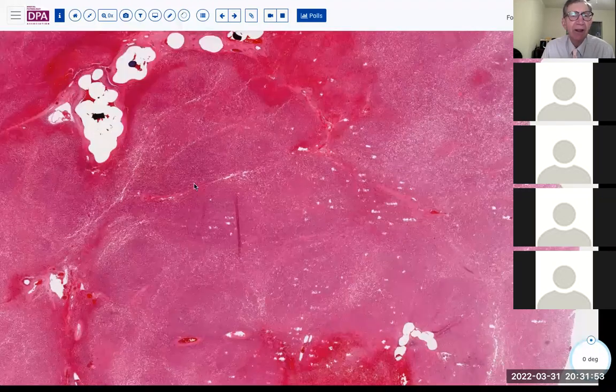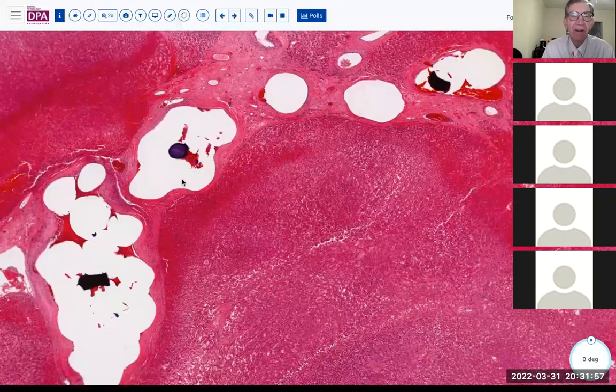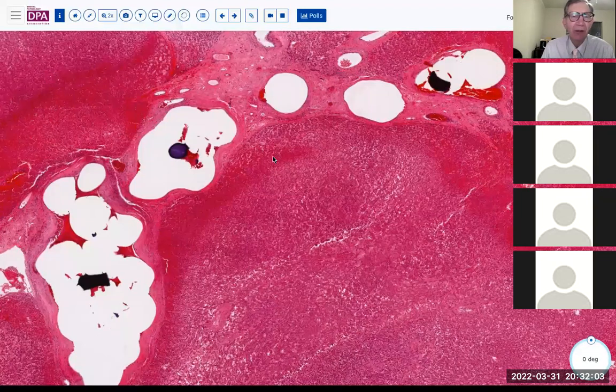But it often leaves us with this sort of nested open spaces and occasionally these blue blobs of the embolization agent. Interestingly, we don't usually see thrombosis associated with this use. So I'm not sure how thrombotic it is, but it is still in fairly wide use.